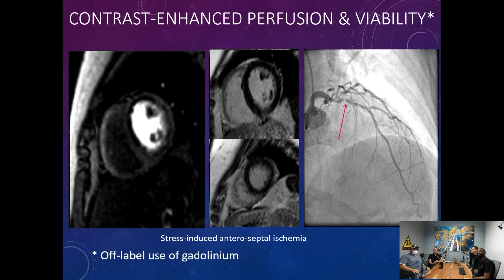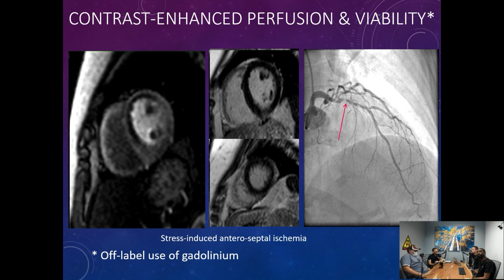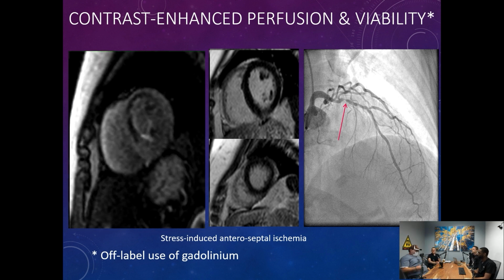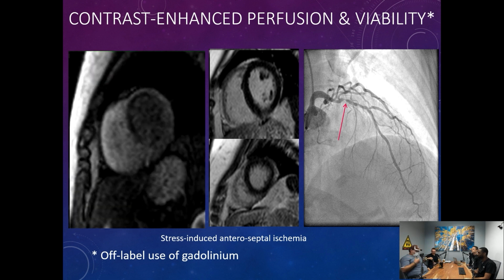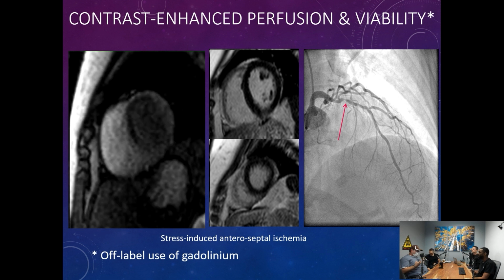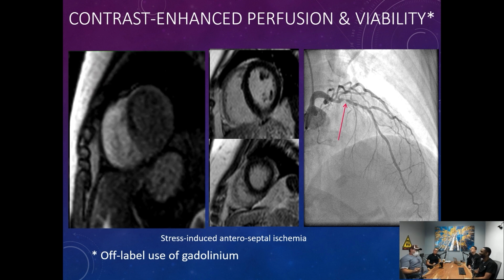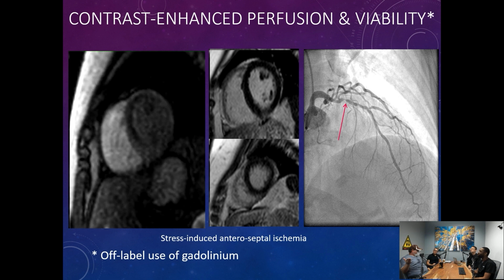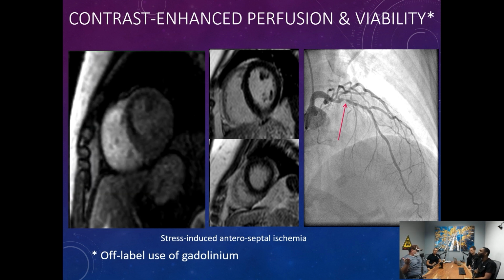Is that also why TI is so important for the contrast of the adjacent tissues, I guess? Yeah, and one of the things about amyloid is that with amyloid deposition, you've got so much of these amyloid proteins around the body, and they sponge up the contrast and pull it out of the blood pool rather quickly. So a lot of times we'll have a lot of trouble setting our inversion time, first of all because there's really not much contrast left. It's almost like, have you guys ever tried to do a TI scout on somebody where the IV infiltrated and you didn't notice? Oh, right? Yep.